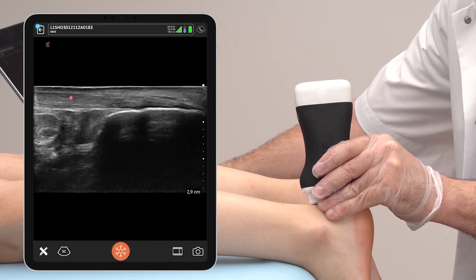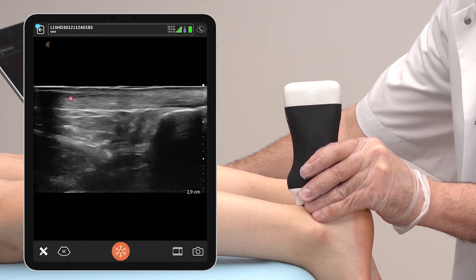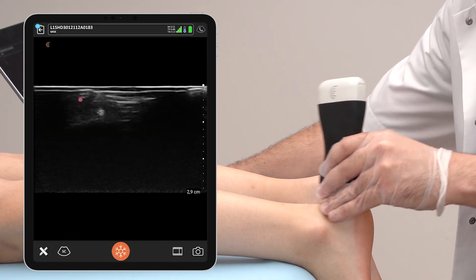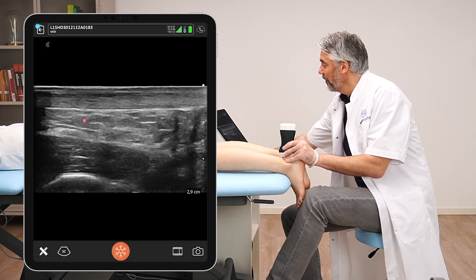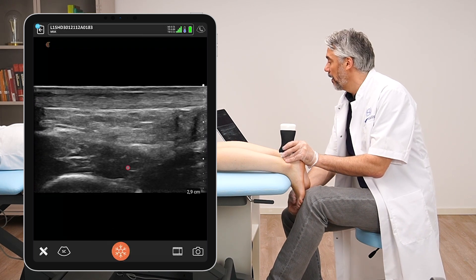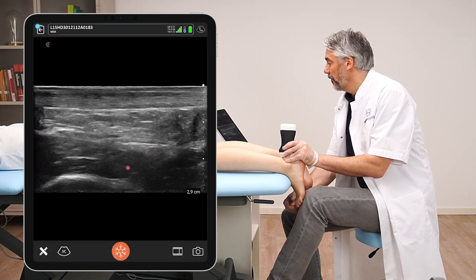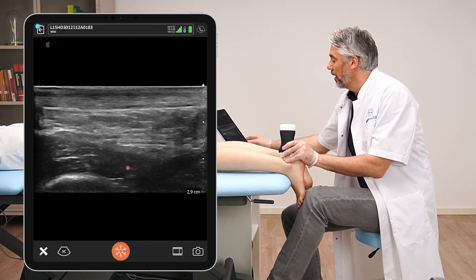We can see the thickness of the Achilles tendon here, and following it proximally you will see underneath the Kager's fat pad. This is Kager's fat pad, and here we can see the flexor hallucis muscle. If I wiggle her big toe, you can indeed see that this is the flexor hallucis muscle moving.